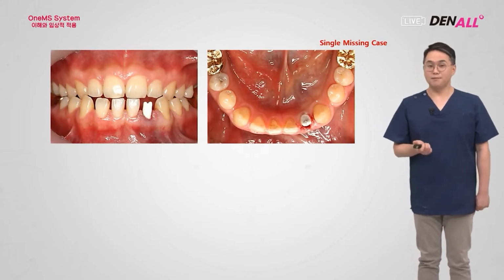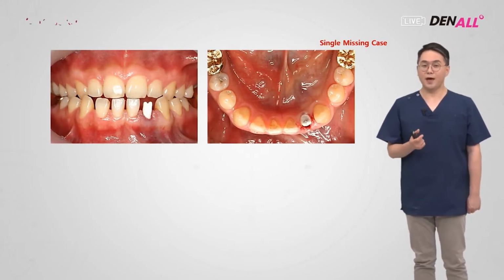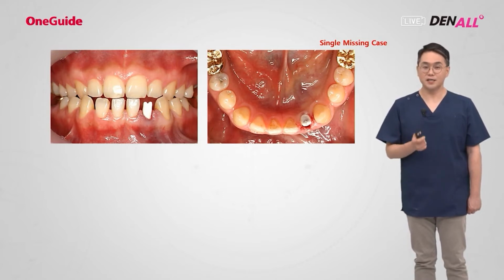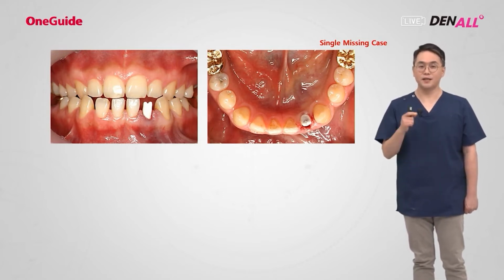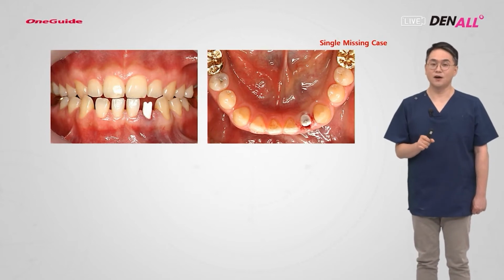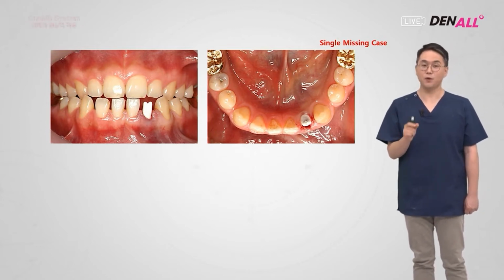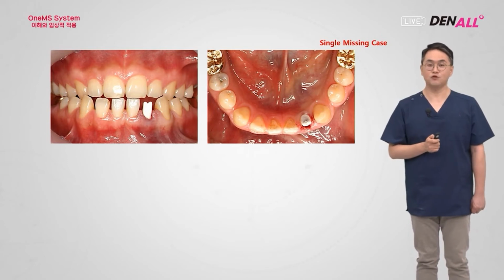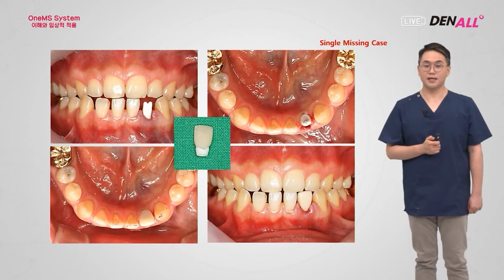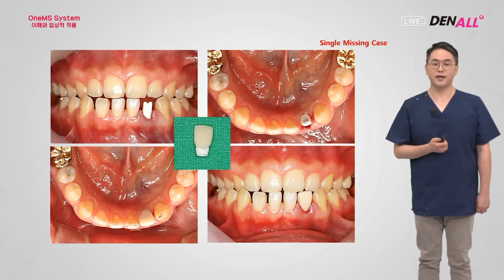As you can see, after placing the MS implant, this is a one-body implant, so a provisional cap is used. The temporary crown is cemented onto the provisional cap. In other words, you don't directly cement to the abutment area of the MS implant. So like a clip-on type prosthesis, the temporary prosthesis can be made. Like this, clip-on type provisionals are made and delivered. After that, you wait for gingival healing and osseointegration.